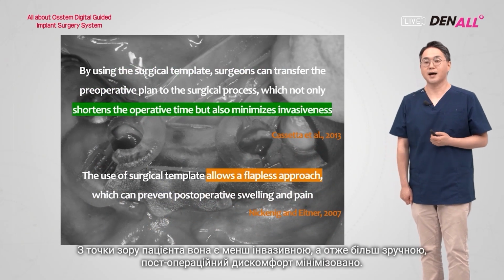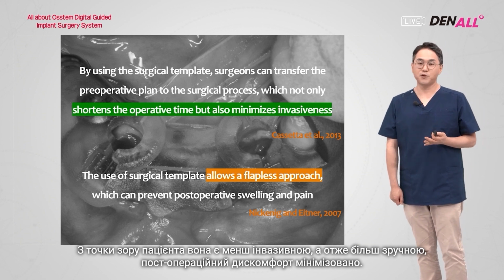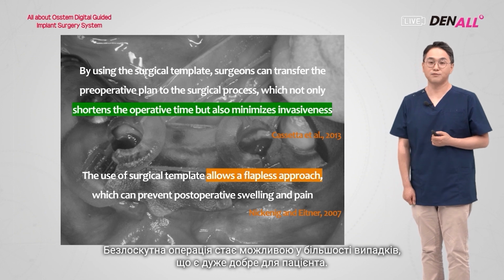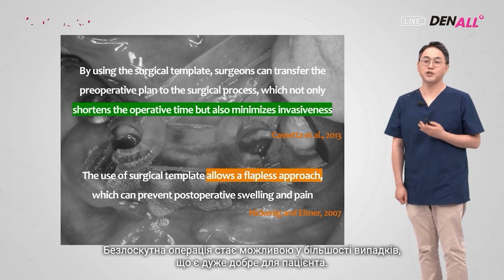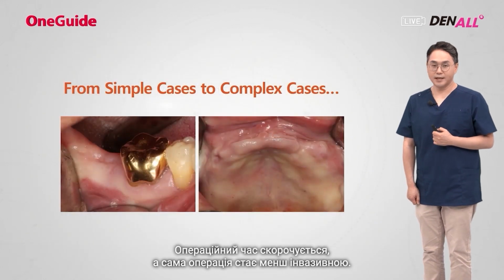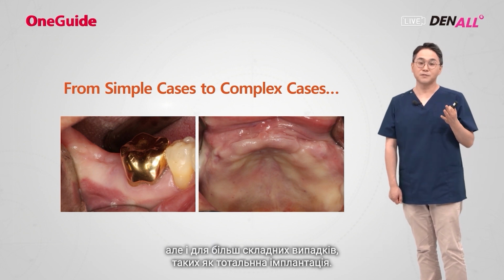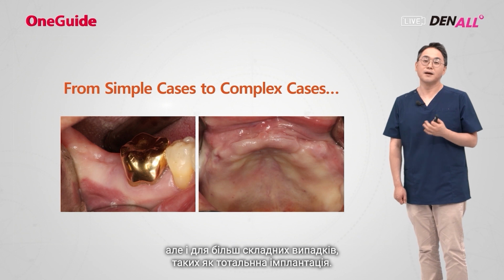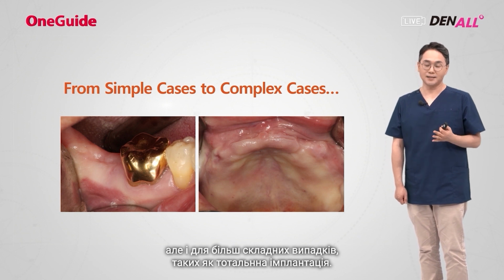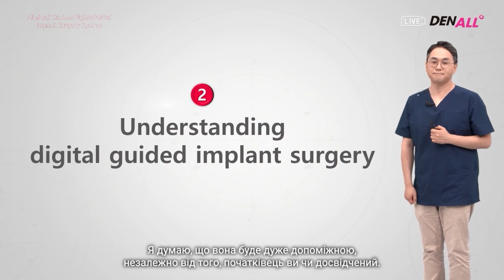From the patient's perspective, it is less invasive, so it's comfortable. Post-surgery discomfort is minimized. Flapless surgery in most cases is possible, so it's very good for the patient. The surgery time is reduced and it becomes less invasive. Digital guided surgery can be applied not only to simple cases, but also to more complex cases like a full mouth implant case. I think it will be of great help regardless of whether you're a beginner or experienced.